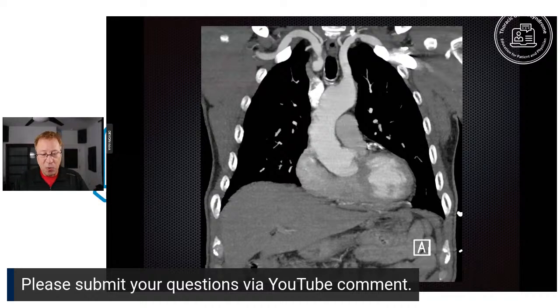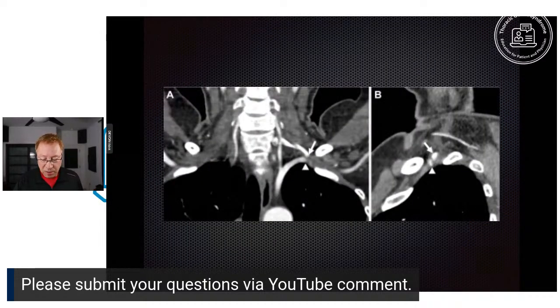So you can see on this how well the vascular structures can be seen with contrast and how all the bones can be seen. And for many docs, that's enough. That's what they need to see. But you'll also notice that the muscles on each side, the grayish things, are very hard to distinguish from one another. And you can't at all tell the nerves from the muscles. So here's another picture, just two pictures from the same area. You'll see again, very bright white bones. That's great. Very bright white arteries because you put contrast in them. But you can't see the muscles from the nerves, so you lose out on the soft tissues. See the blood vessels, but the rest of the soft tissues you can't tell apart.